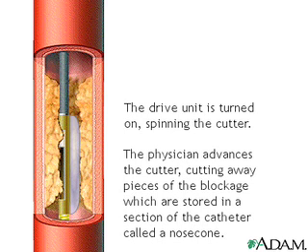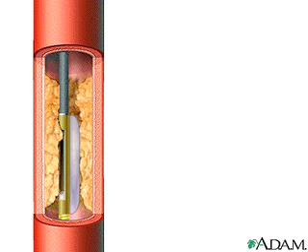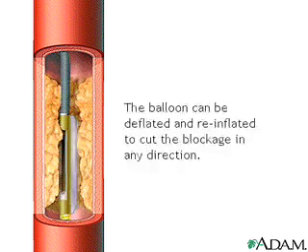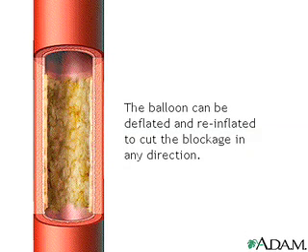A drive unit, located at the proximal end of the catheter, is turned on, spinning the cutter. A lever on the drive unit is advanced by the physician, which in turn advances the cutter, cutting away pieces of the blockage. These lesion pieces are stored in a section of the catheter called a nose cone, and removed after the intervention is complete. Together with rotation of the catheter, the balloon can be deflated and re-inflated to cut the blockage in any direction, allowing for uniform debulking.